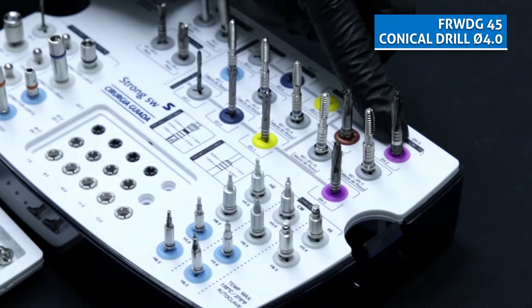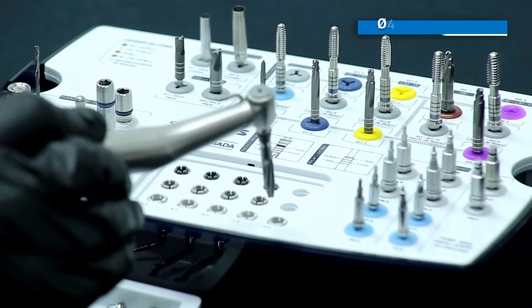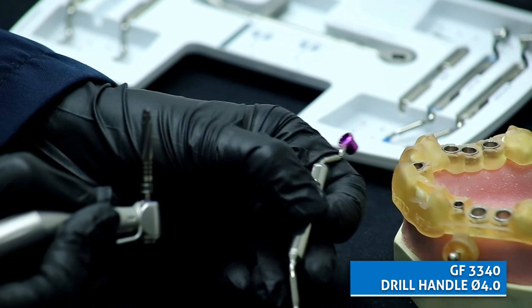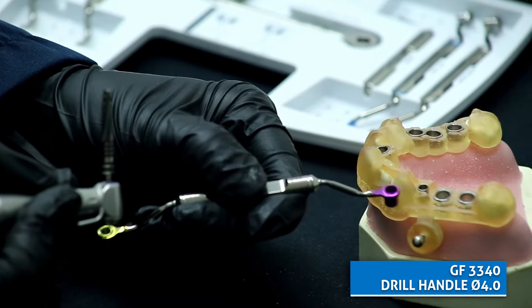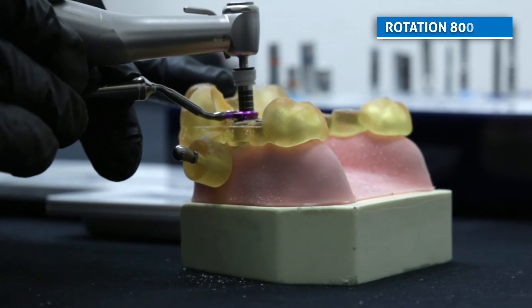The next and last drill is the conical drill 4.0. Fit it to the hand piece, select safe drill stopper 4.0 per 13mm. Select the drill handle 4.0 at the other end. Fit it to the guide sleeve and repeat the drilling.